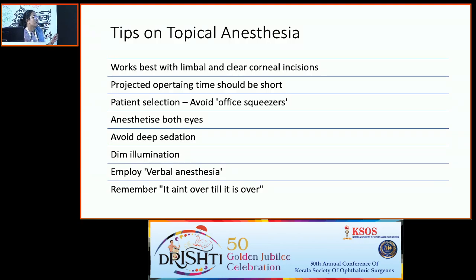Avoid deep sedation because we want our patient to comply with all our instructions, and in deep sedation that might not be possible. Start with a very dim illumination and gradually increase so that we don't startle the patient. Verbal anesthesia is extremely important. Tell the patient, we are going to place the drape, or now you're going to hear the sound of the phaco machine.